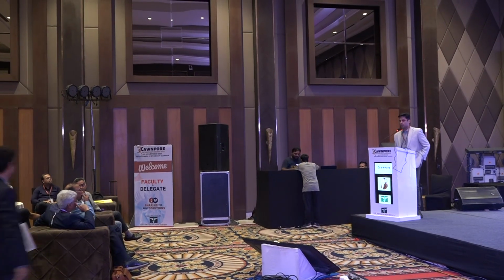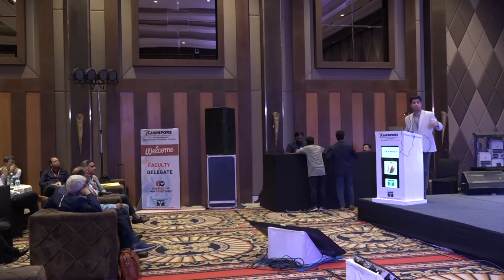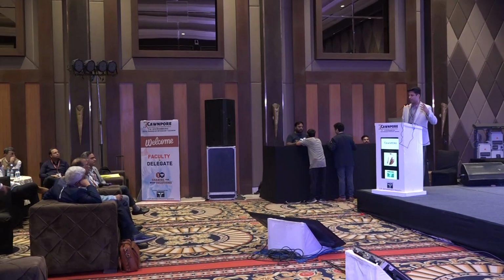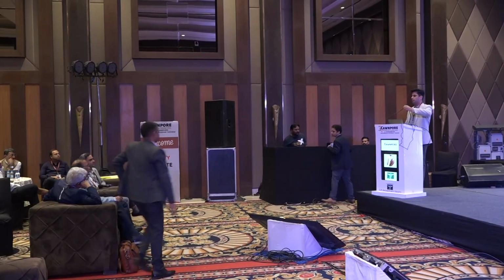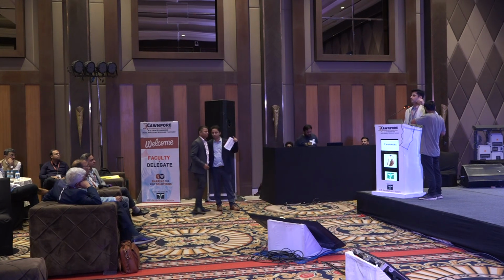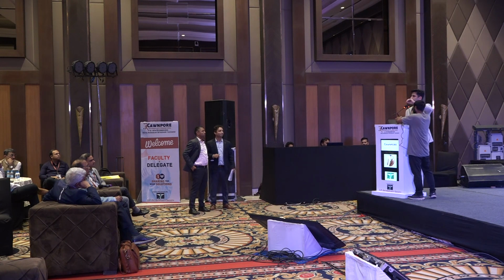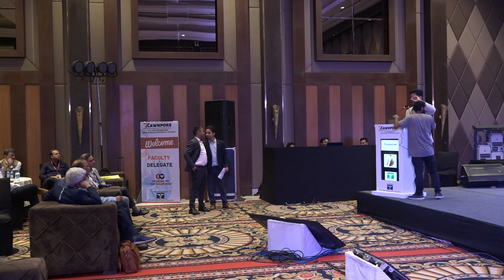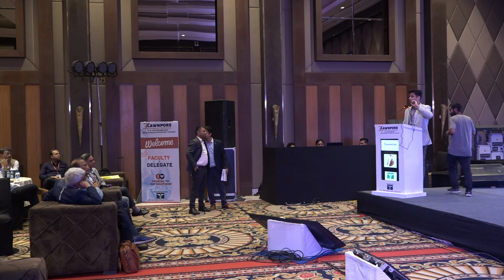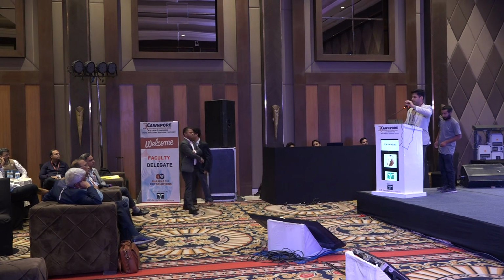Now I wanted to show a small video which is basically of a cement in cement revision, but for lack of time, I'm just going to skip that because it shows that you can just pull out that cemented stem and then you can just use a burr or use a cement dissolving ultrasound device and just open the space a bit so you can create a slightly bigger size canal along with the cement inside.